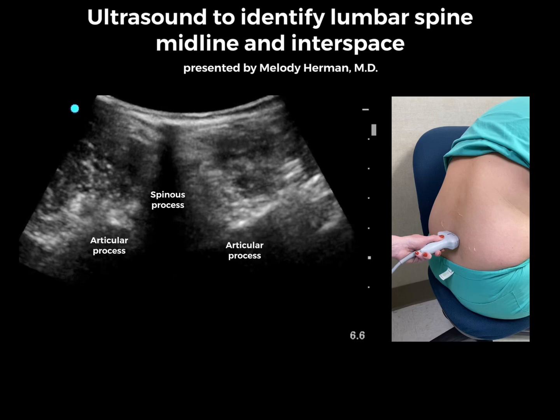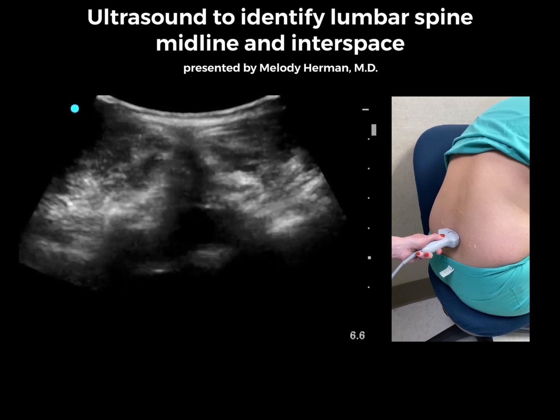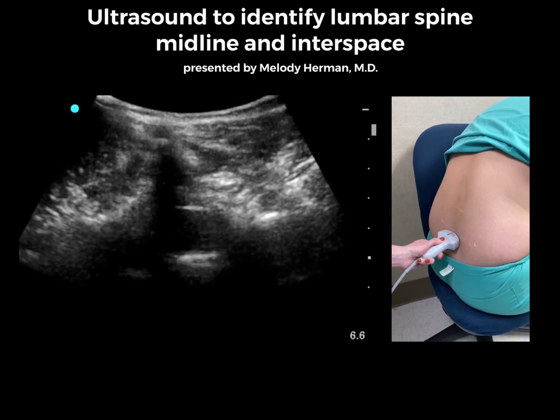Start by placing the ultrasound probe over the spinous process to identify the midline. The shadow of the spinous process is blocking our view of deeper structures, so I'll slide a little cephalad and caudad and apply some tilt.